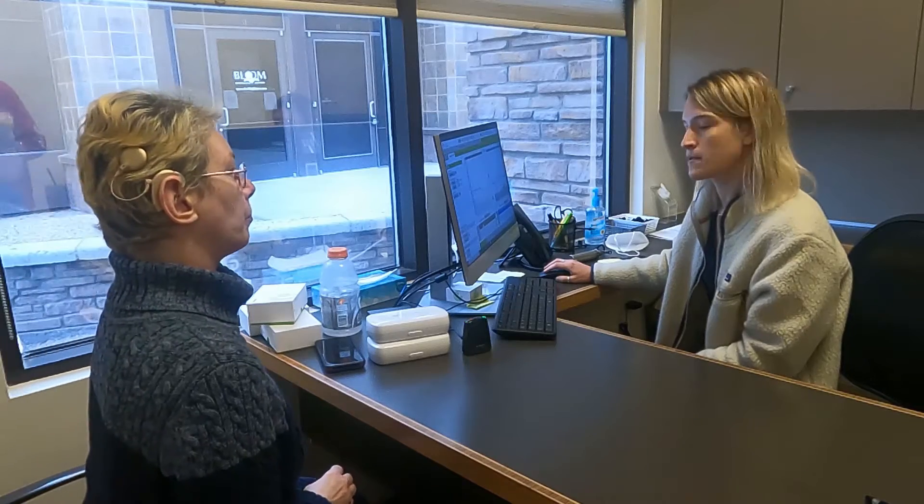Let me save this and we'll do some testing, then come back and do some adjustments. Madeline just took Sarah into the hearing test room and she's just going to check out her hearing, then she'll come back and continue the setup process.